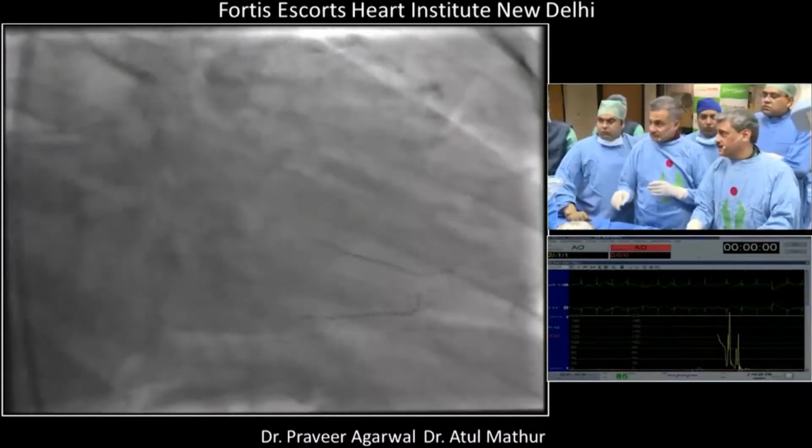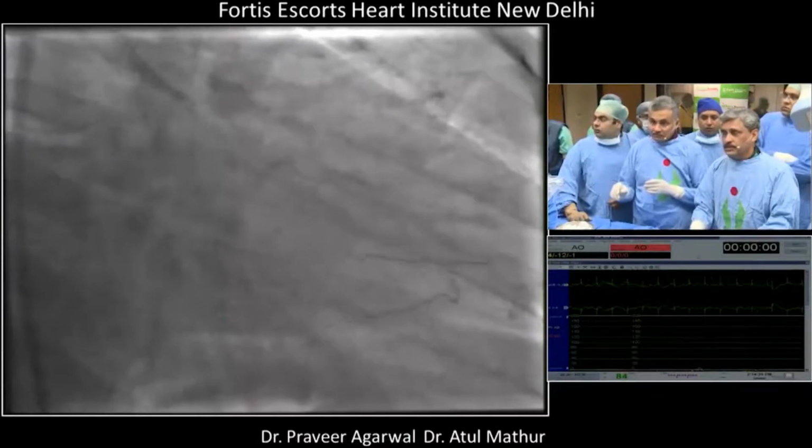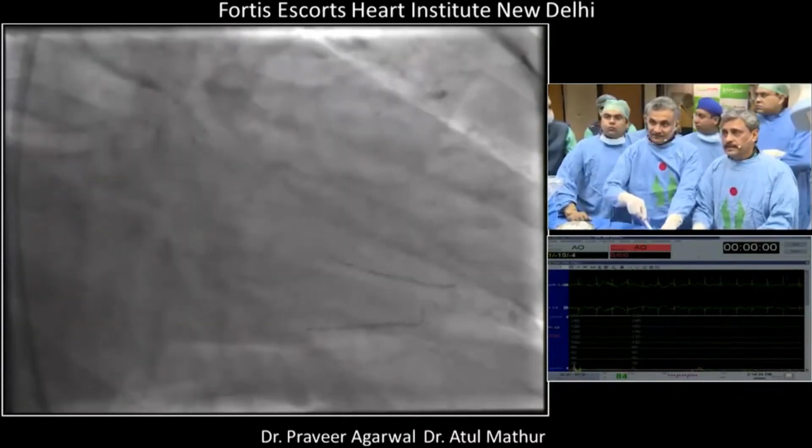Do you have an IVUS ready? No, they're not ready yet. They'll have to take time. So we are skipping the IVUS. Okay.